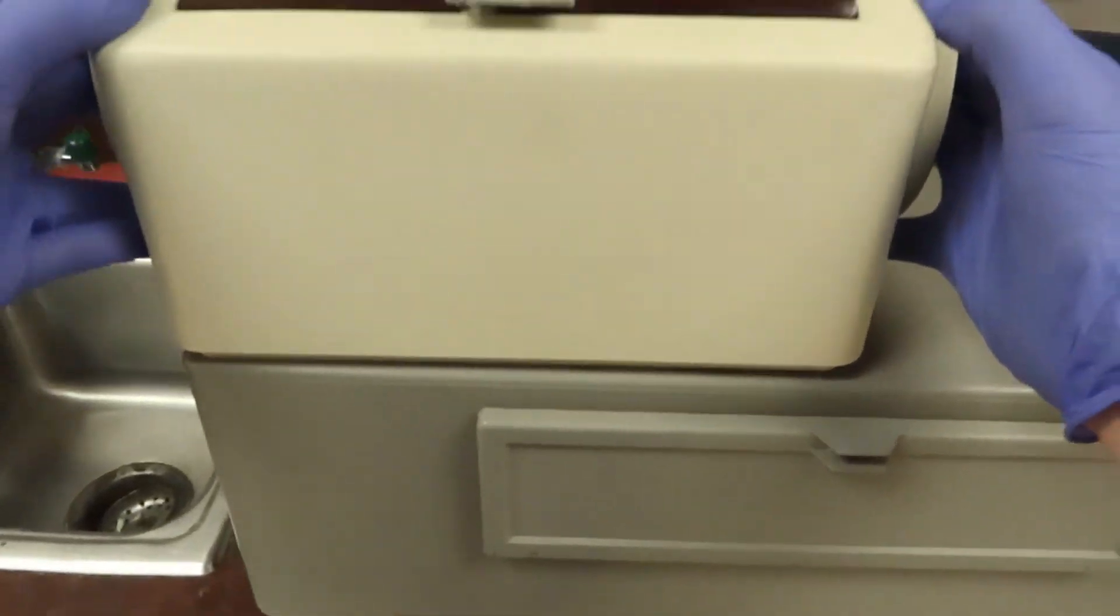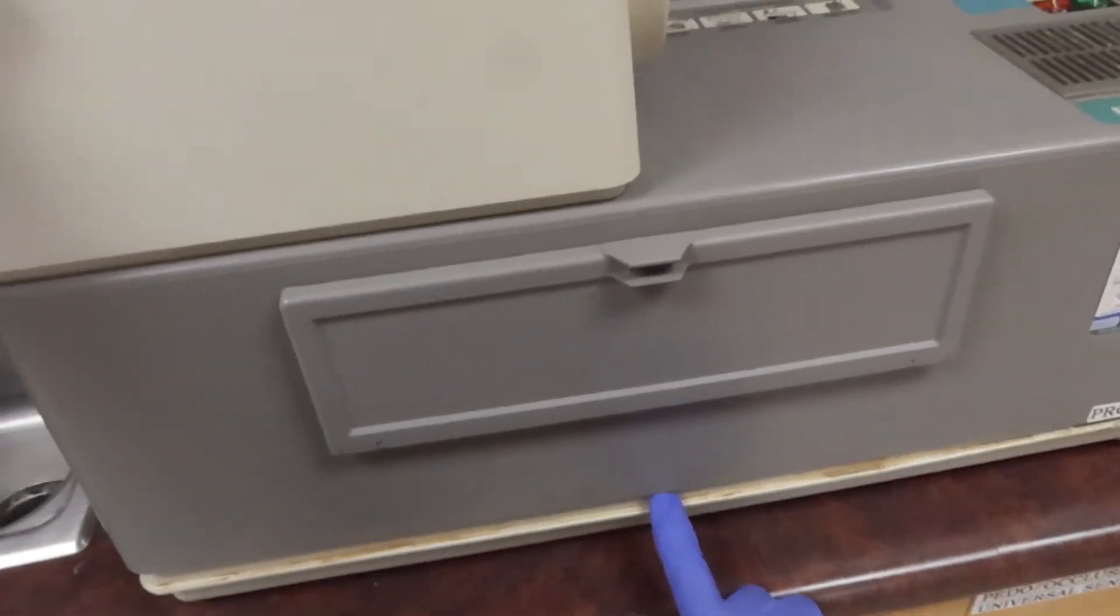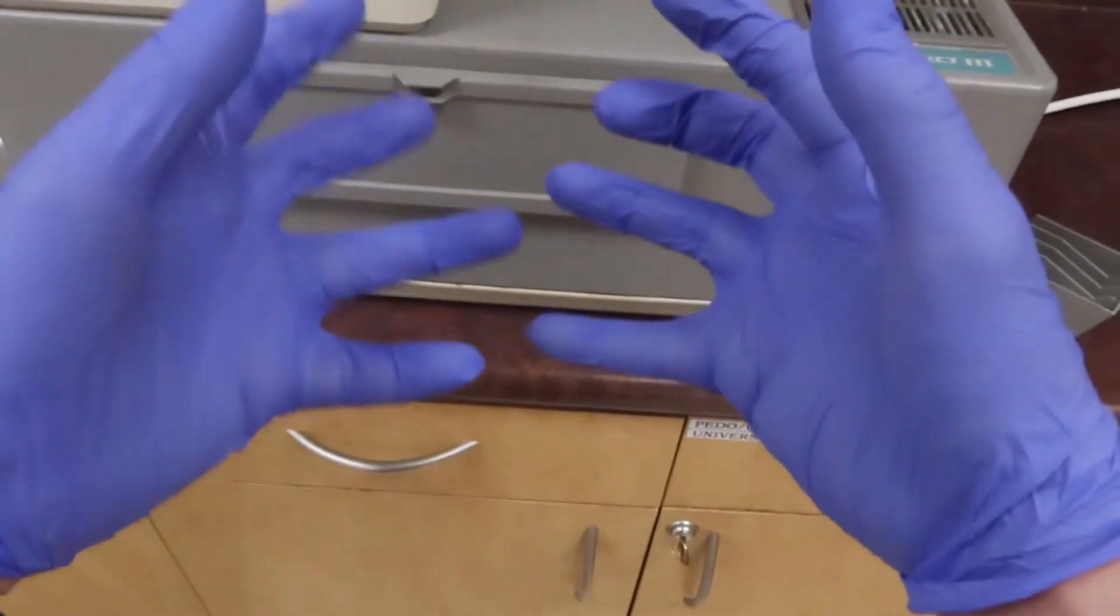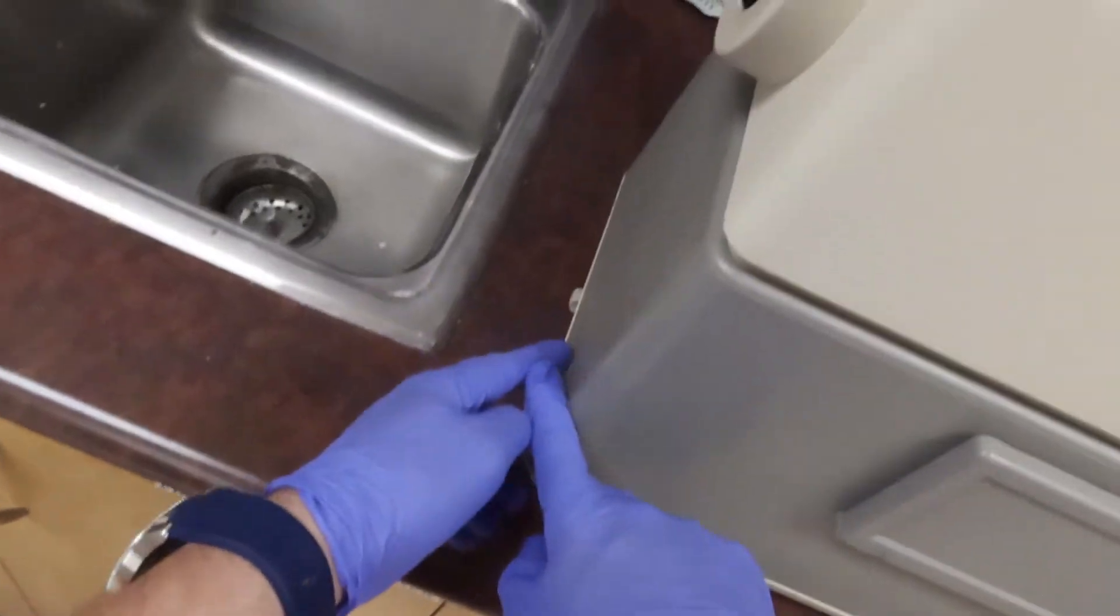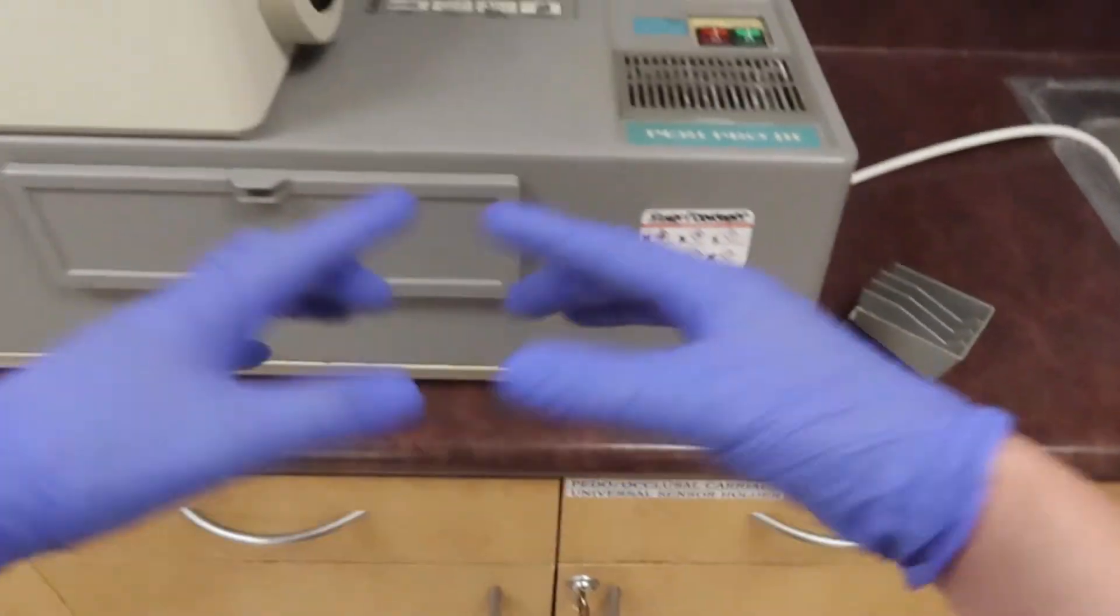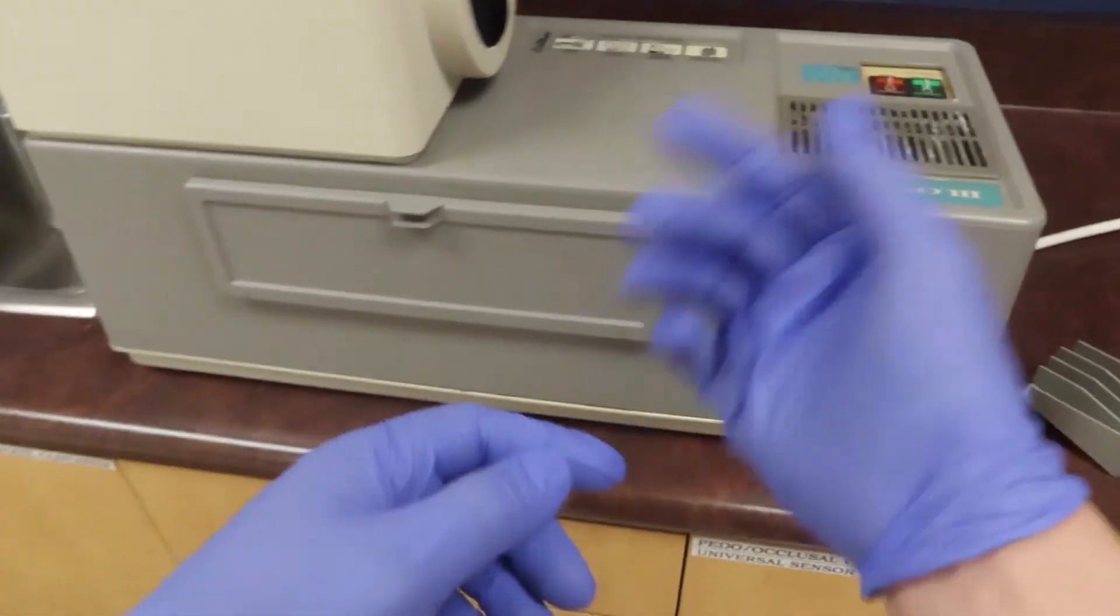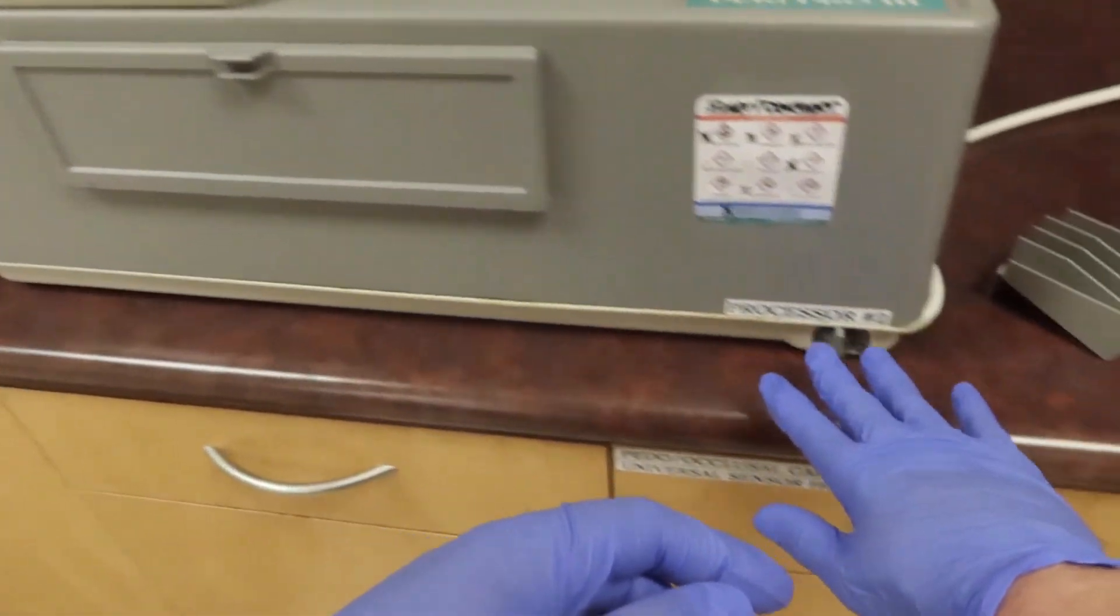Make sure that this is nice and snug so that we don't have any light that can pierce through here and ruin our x-rays, getting us super frustrated. Now that I've checked over all my pieces and it looks like it's all good, one thing that's going to stick out from this - the water bin is going to drain out over here where we have this little drain knob.